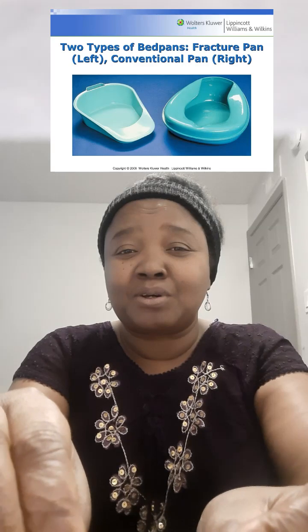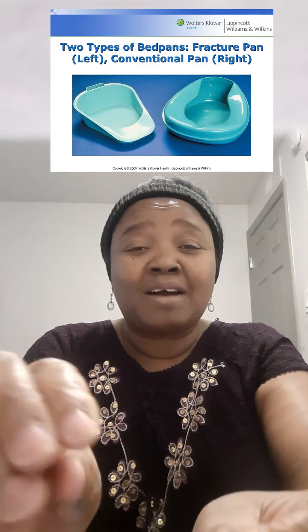So there are two types of bedpan. There is the regular bedpan, and then there is the fracture bedpan. That one is used with patients who have limited mobility. Maybe they have a back injury, they had a fracture, so they cannot move as much as regular patients. So that one is easier to slide under the patient.